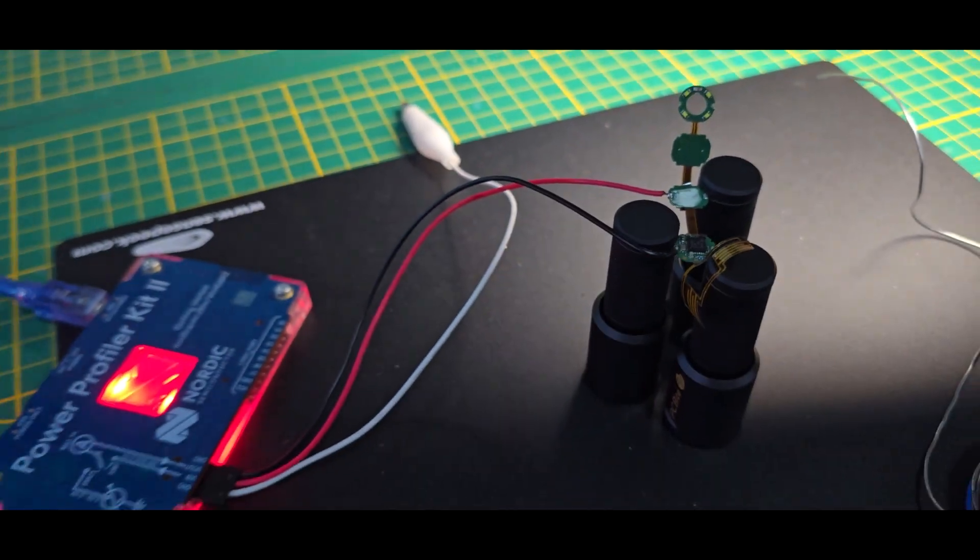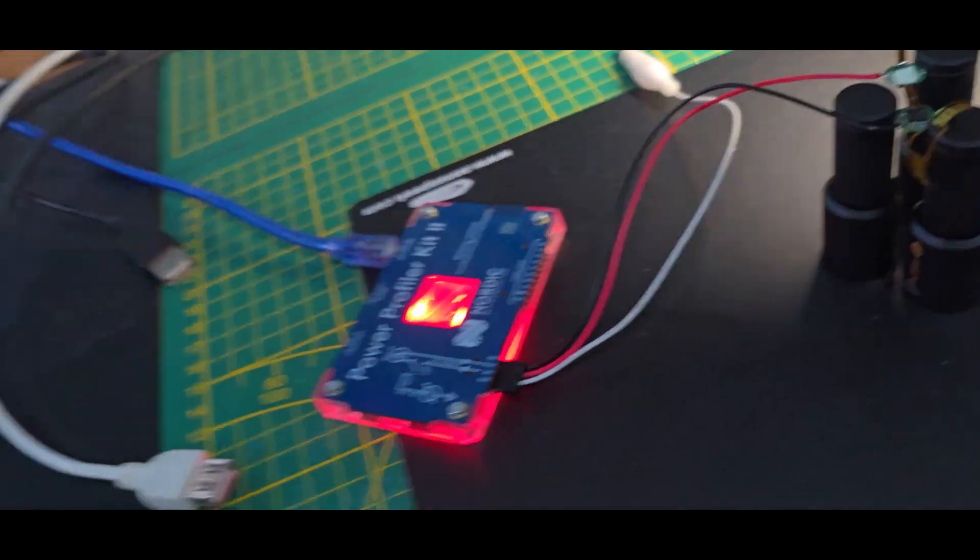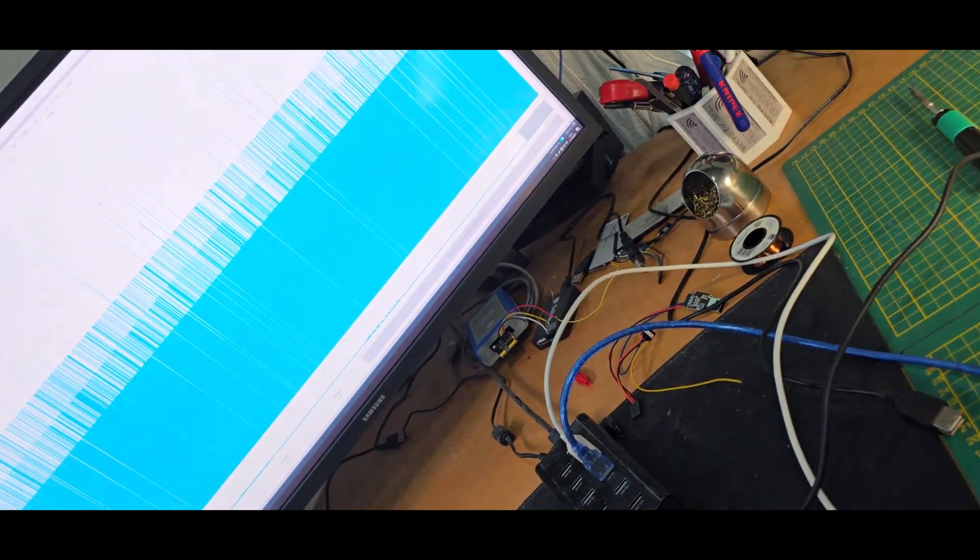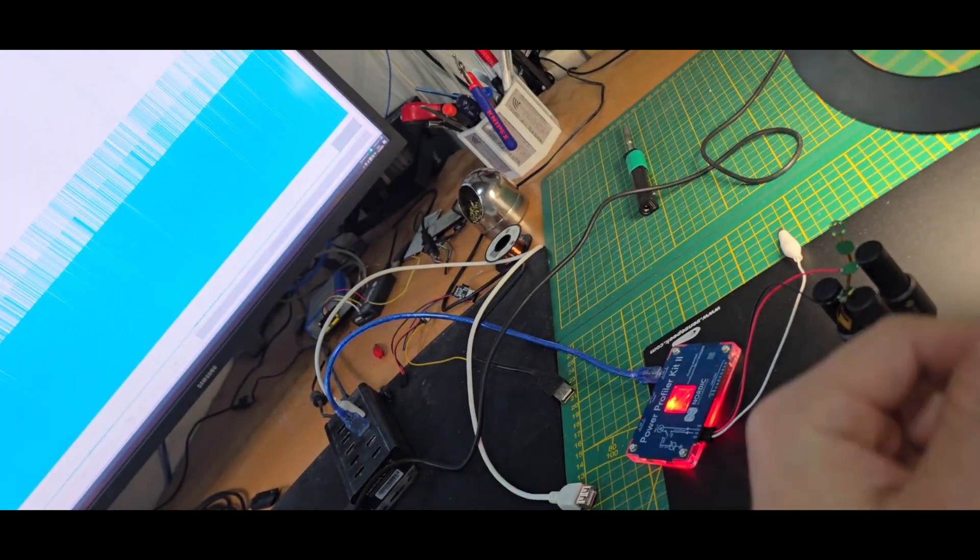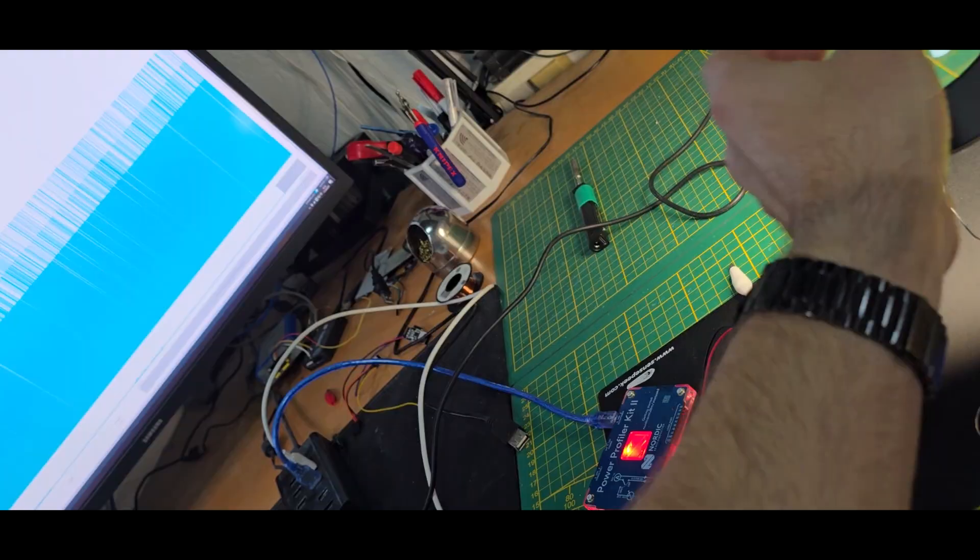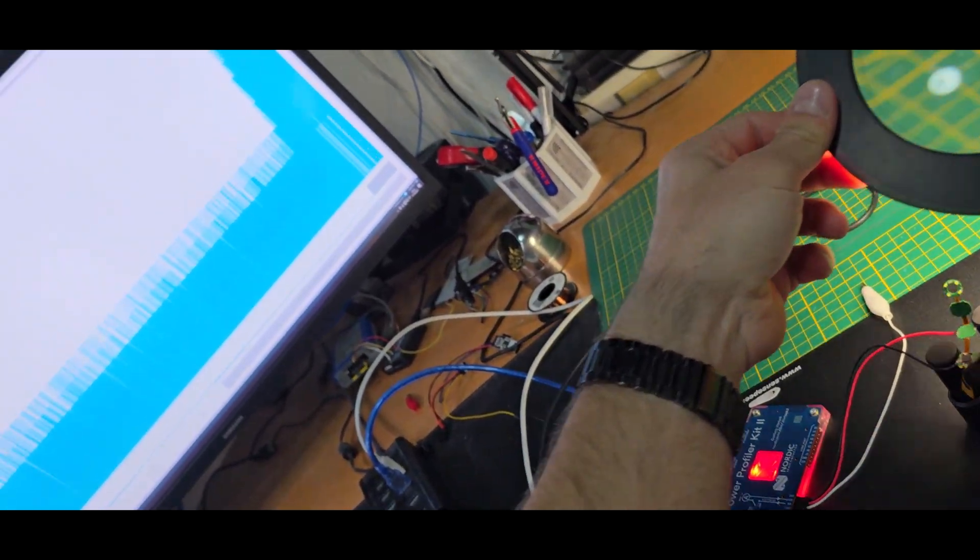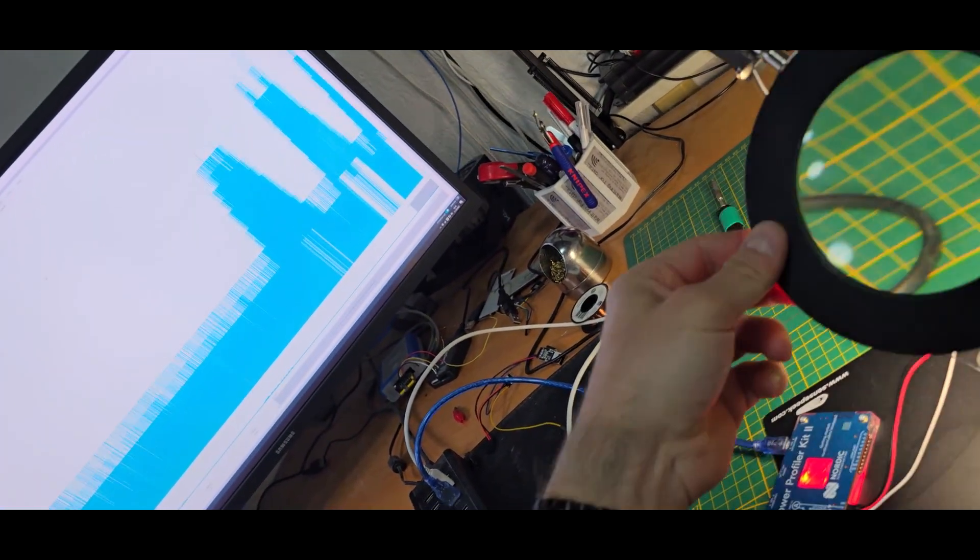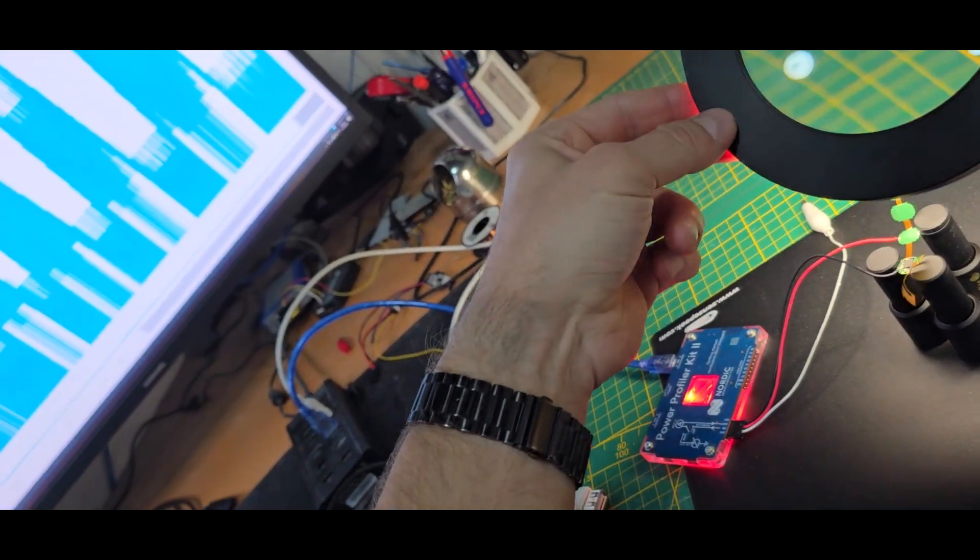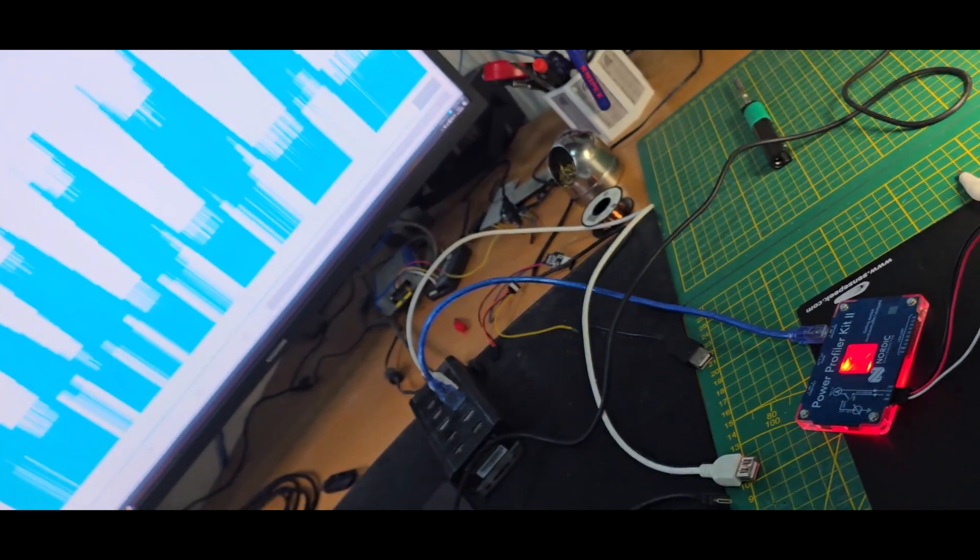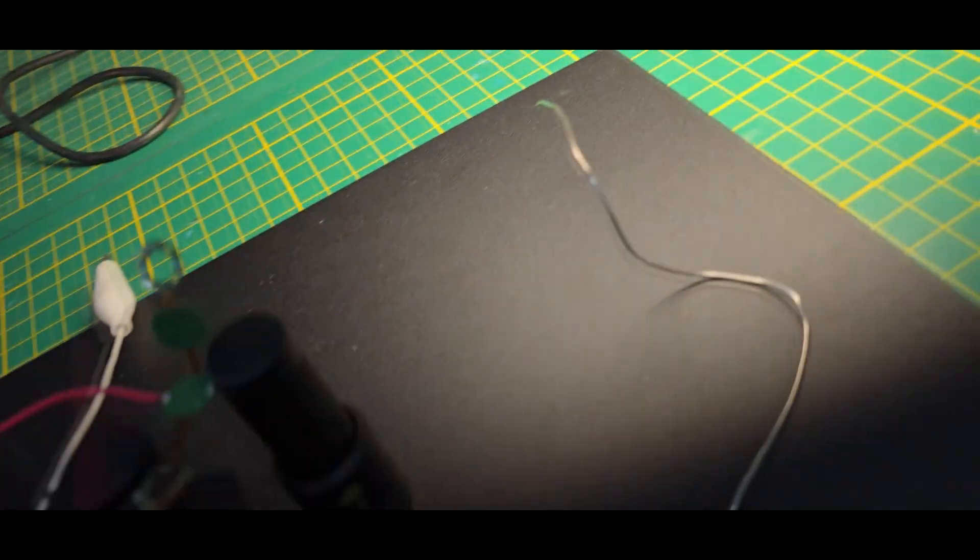Short info. So after connecting power to it with the PPK, so we can see the current draw from it, it's still in some kind of sleep mode. But the moment some light is shining onto this sensor, we can see the current draw goes up a bit.